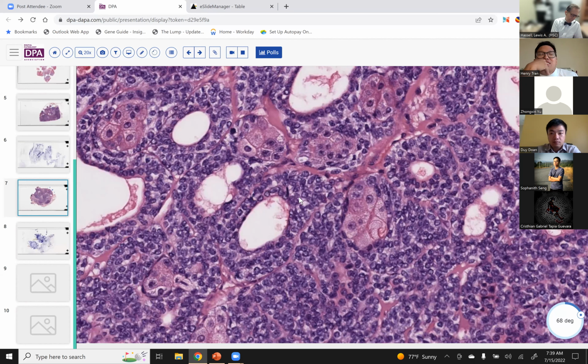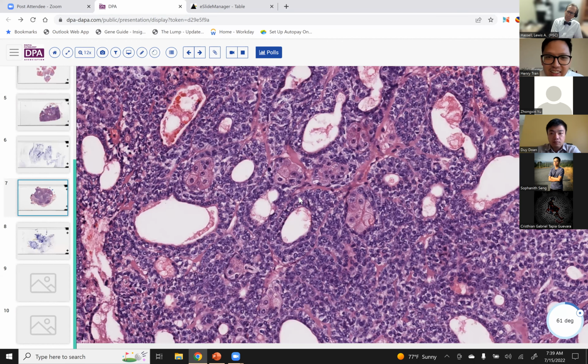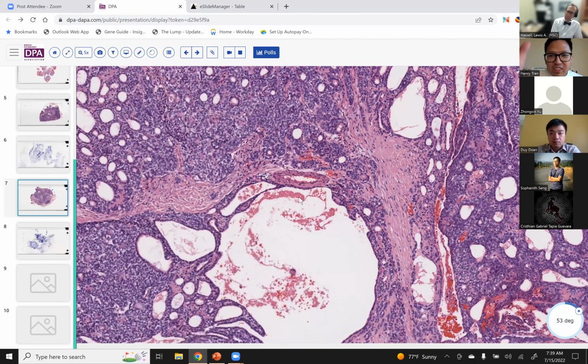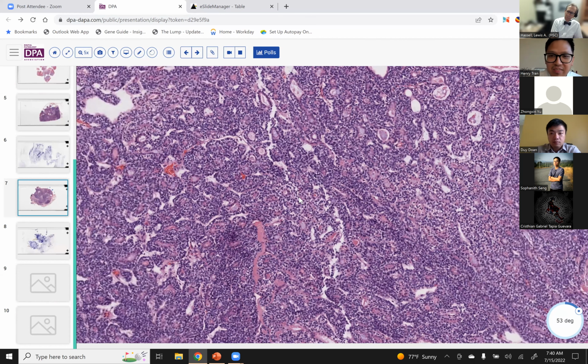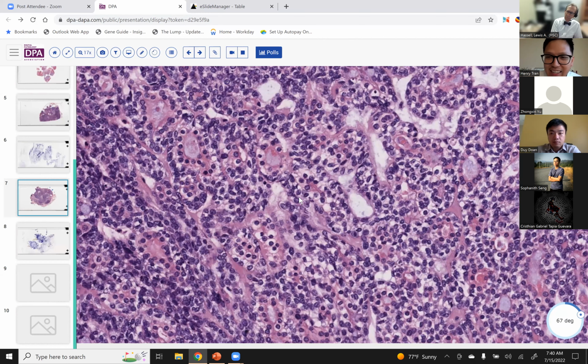So actually, I just Googled salivary gland tumors with sebaceous differentiation, and I came upon myoepithelial carcinoma as something that very commonly has this. And then, of course, I showed it around to people who see more salivary gland tumors than I do, and they were able to figure out right away that yes, these were myoepithelial cells. But I came about the diagnosis in a more indirect way.